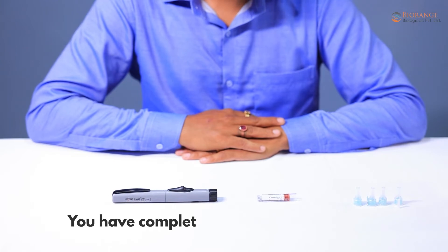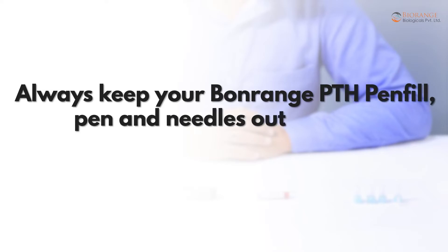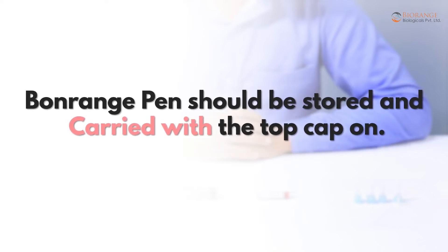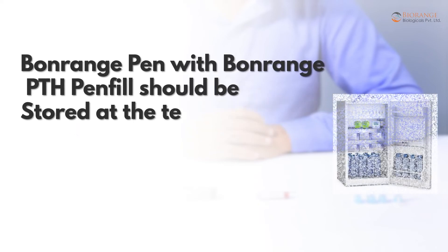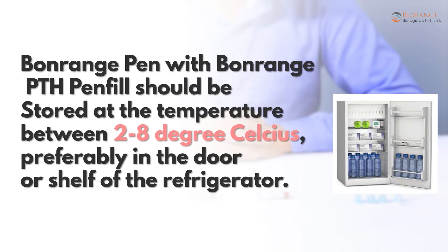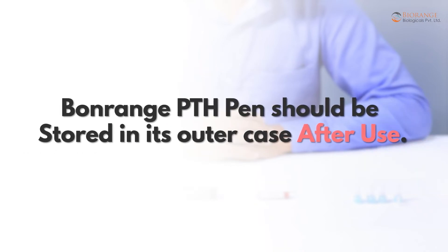You have completed your teriparatide injection. Always keep your Bonrange PTH pen fill, pen, and needles out of reach of other people, especially children. Bonrange Pen should be stored and carried with the top cap on. Bonrange Pen with Bonrange PTH pen fill should be stored at a temperature between 2 to 8 degrees Celsius, preferably in the door or shelf of the refrigerator. Bonrange PTH pen should be stored in its outer case after use.